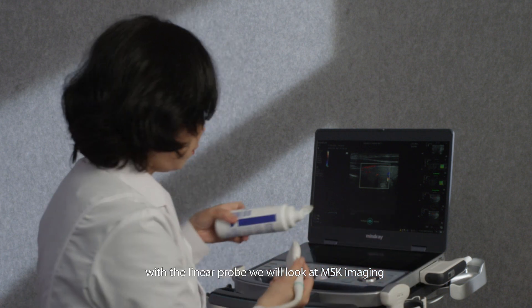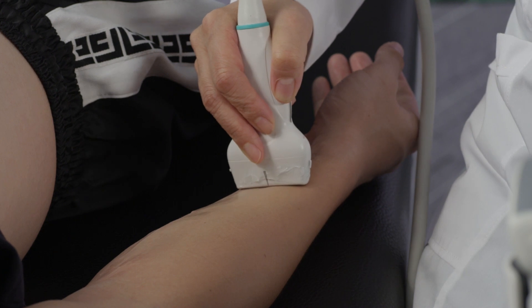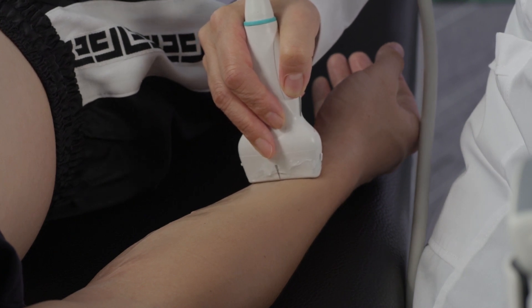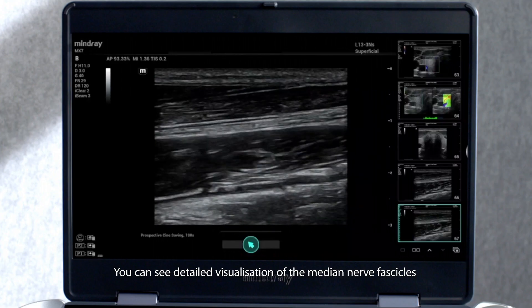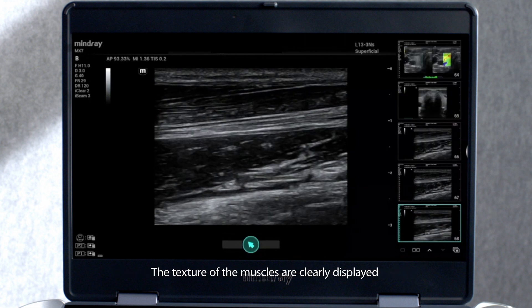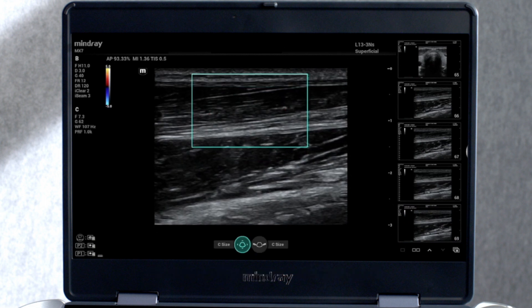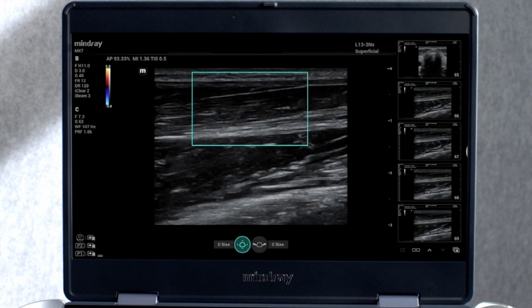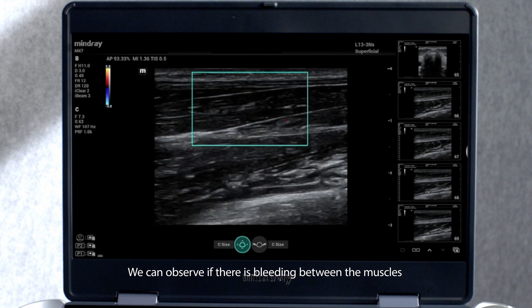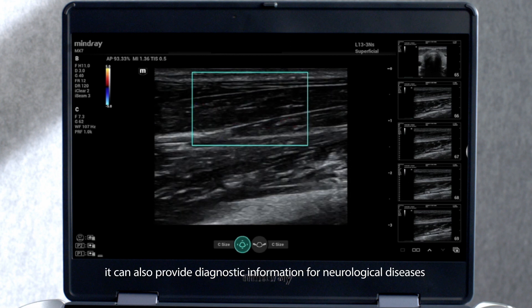With the linear probe, we will look at musculoskeletal imaging. You can see detailed visualisation of the median nerve fascicles. The texture of the muscles is clearly displayed. We can observe if there is bleeding between the muscles when damage to the structure occurs. It can also provide diagnostic information for neurological diseases.